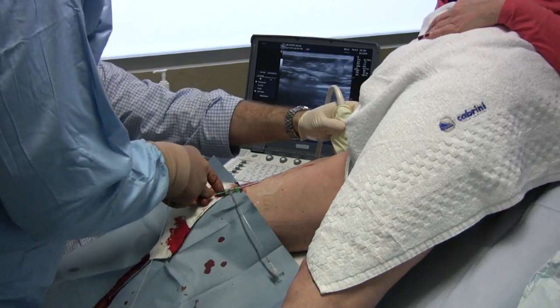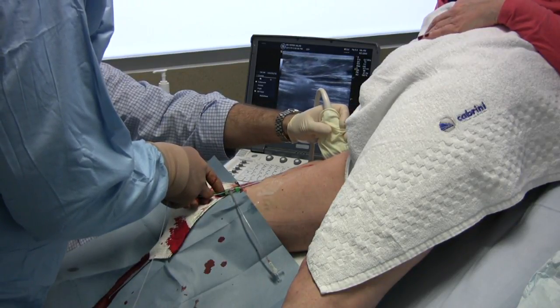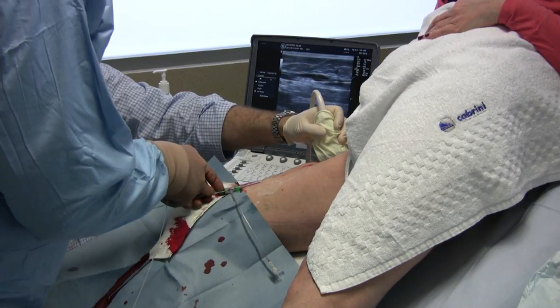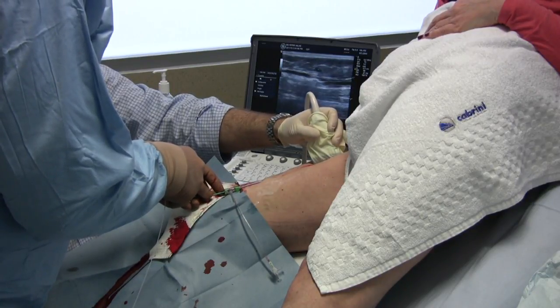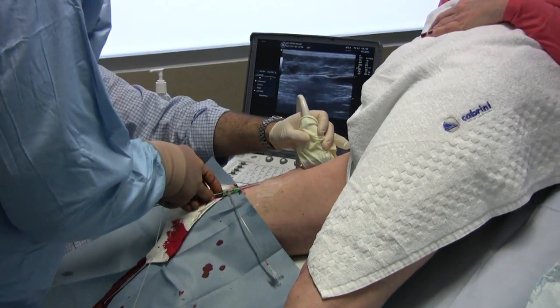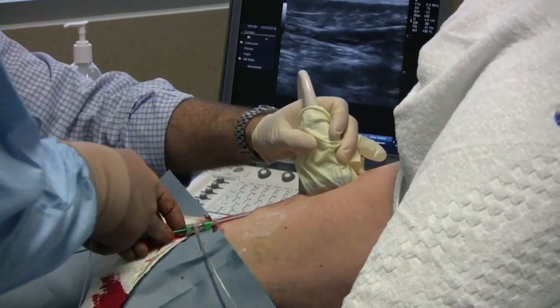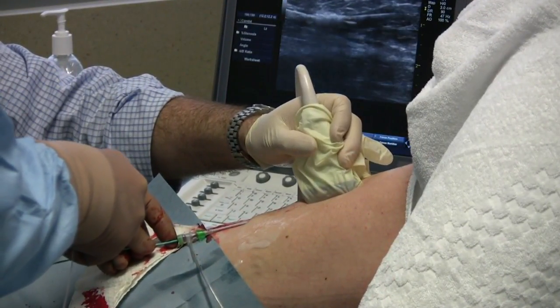If you look at the screen, you can see the tip of the laser and the vaporization of the vessel contents occurring at the tip of the catheter and fibre itself. This results in accurate delivery of the minimum amount of thermal energy to obliterate the vein.